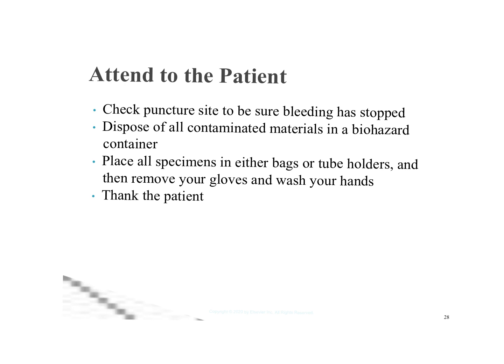Attend to the patient. Check that puncture site to be sure the bleeding has stopped. Some patients' veins don't close automatically, and so we do have a little bit more bleeding. So I always have them hold that pressure as I'm cleaning up, and before I put tape on that, I'm going to lift that up a little bit, peek, and make sure that vein has stopped bleeding.